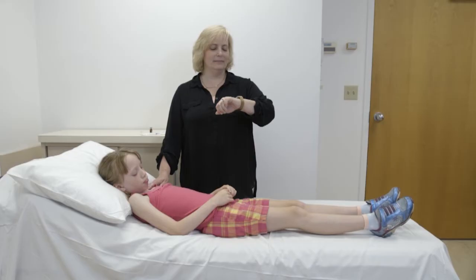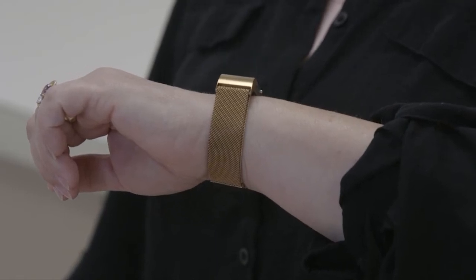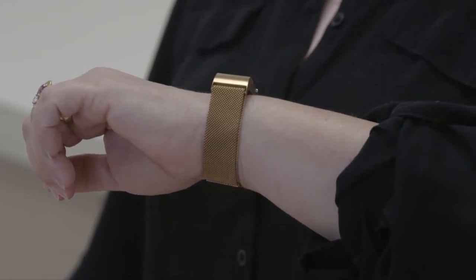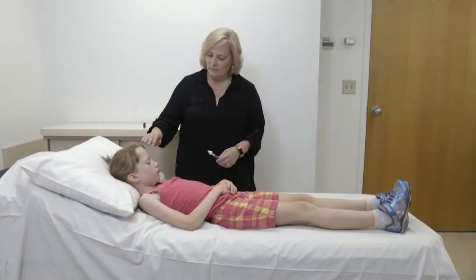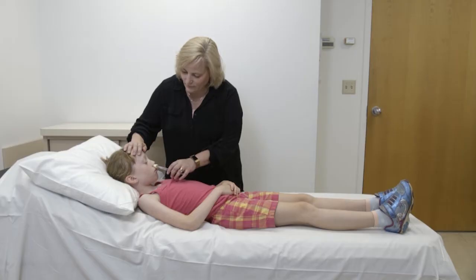When your child has a seizure, please remain calm and remember to time the seizure. Most seizures will stop on their own. However, if your child's seizure lasts longer than your doctor would like it to, then you will need to administer the midazolam medication as follows.